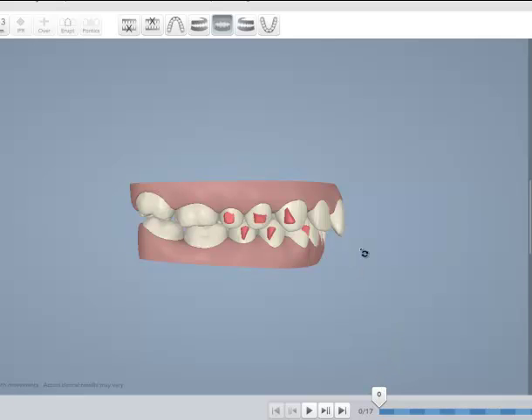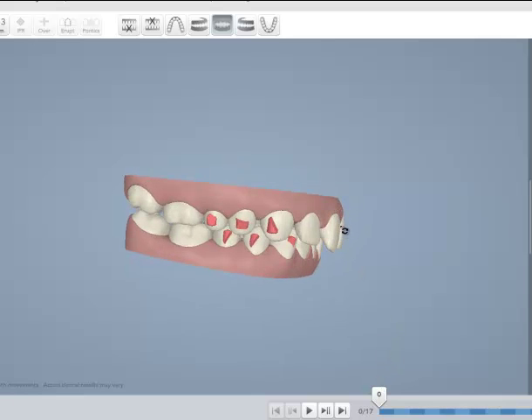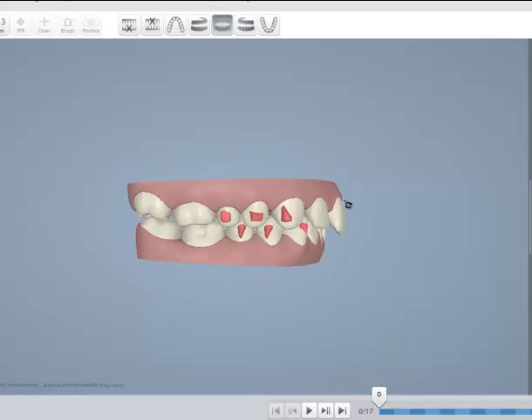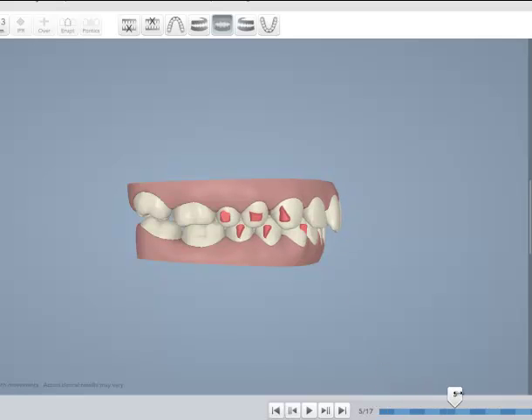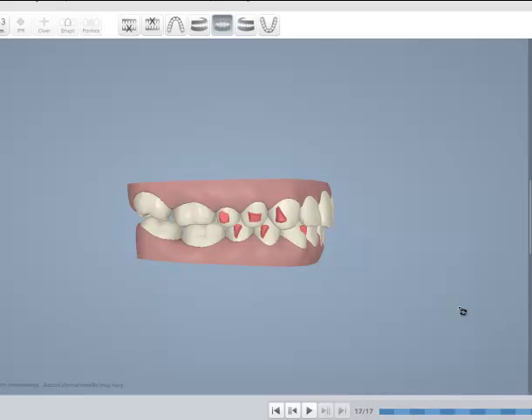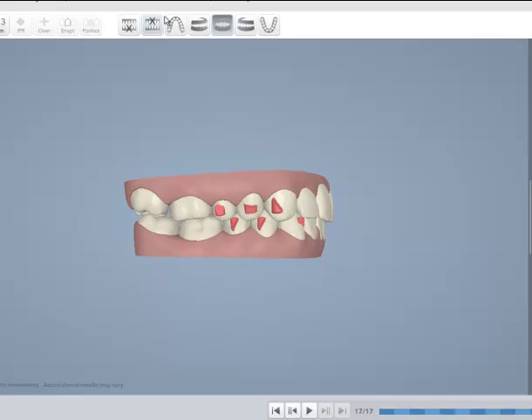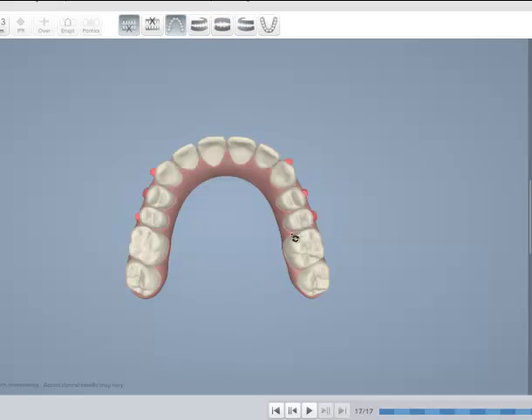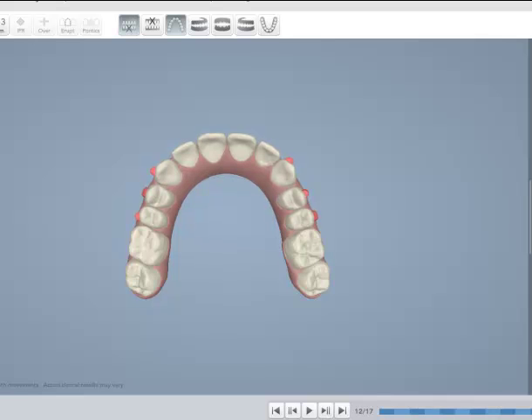This type of movement, bodily movement of the upper incisors—as you can see, there is some tipping but it's bodily movement—would be better off with power ridges. Why all the attachments, even if there's not a whole lot of movement as you can see?